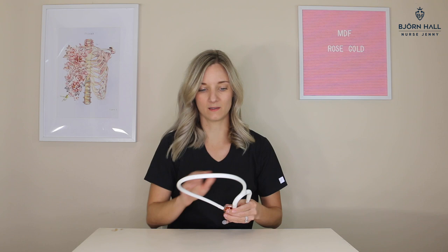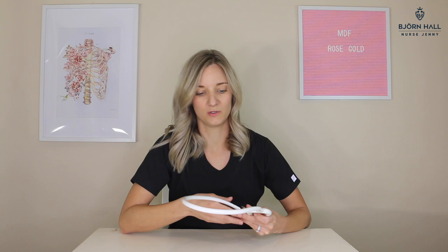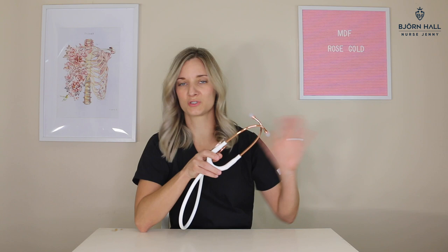This stethoscope is white, so of course you're going to have to be careful with it — really careful not to put stains on it. I wore it with a new pair of blue scrubs, and unfortunately I did get a little bit of a blue mark on it that I can't get off. So if you buy something white, it's like buying a white shirt — you're going to get stains unless you're careful. Do keep it in a stethoscope case when you're not using it, because the rose gold metal can also get scratches. Don't just throw it around; treat it like a piece of jewelry.